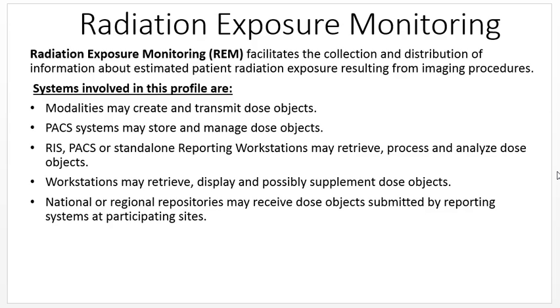The REM profile requires imaging modalities to export radiation exposure details in a standard format. Radiation reporting systems can either query for those dose objects periodically from an archive or receive them directly from the modalities. The radiation reporting system is expected to perform relevant dose quality assurance analysis and produce related reports.